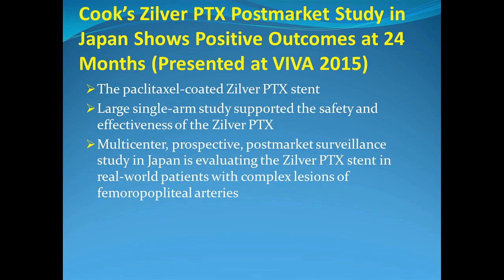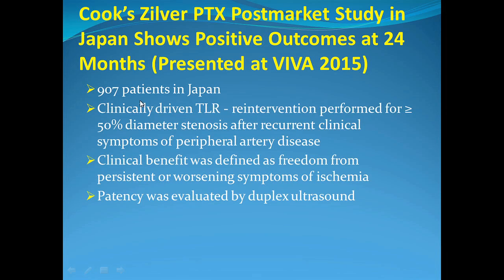This is the data that was presented at VIVA. It is not peer reviewed and not published. It is the Cook Zilver PTX post-market study in Japan. The paclitaxel coated Zilver stent, single arm, done in Japan, a multi-center prospective post-market surveillance study, which included 907 patients.